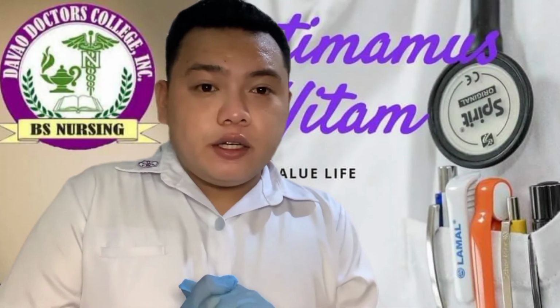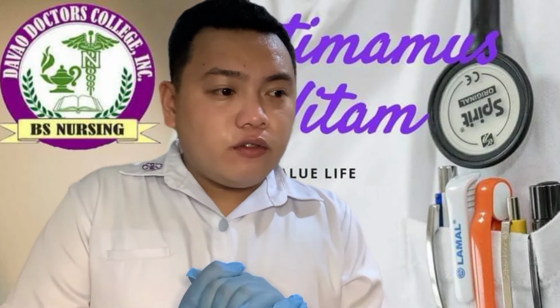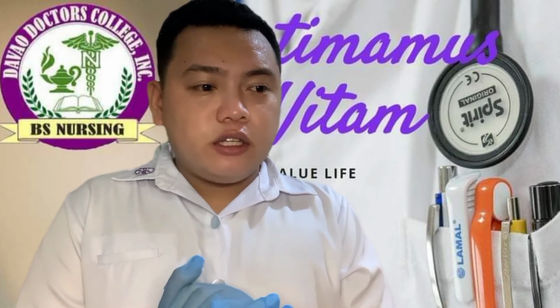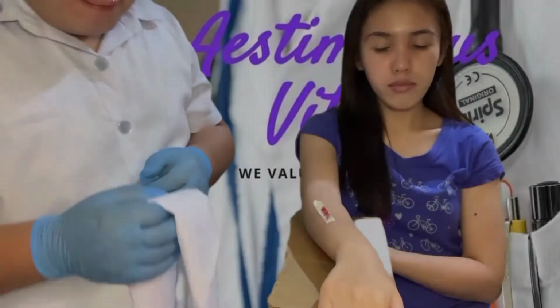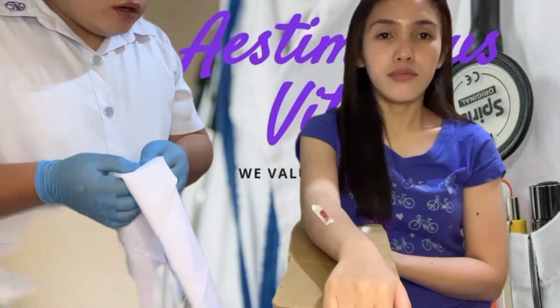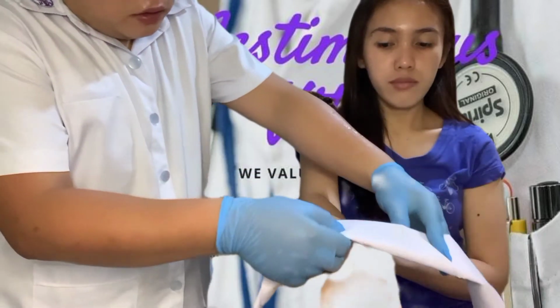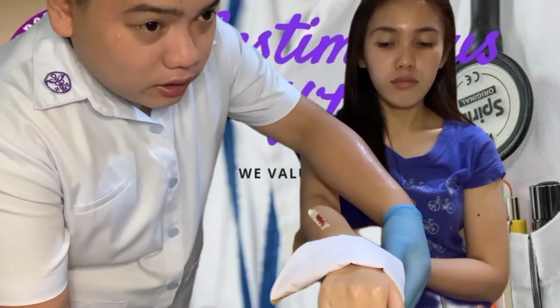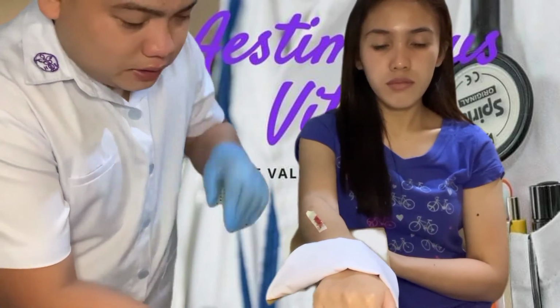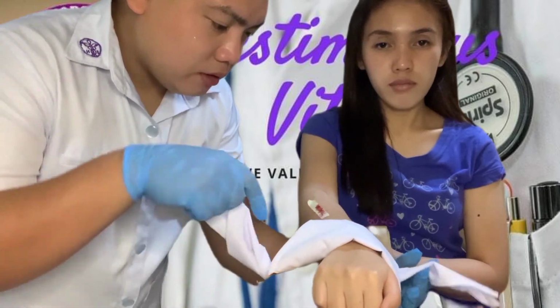The next step is you need to secure bandages. First is tie several folded triangular bandages or any available cloth above and below the injured body part. So now I'll be putting the bandage first on the area above the injured part. So make sure to make the knot on the splint side so that you will not impede the circulation of blood.